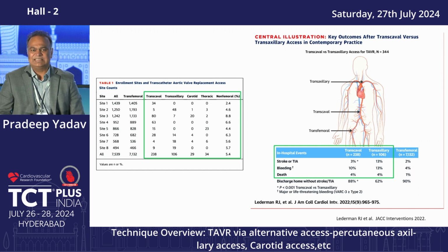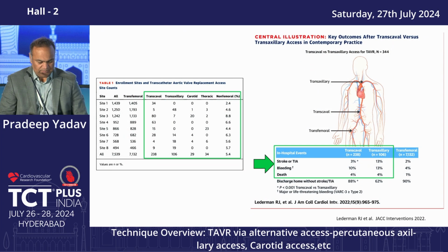Transcaval, so we haven't seen any excessive risk of stroke with transcaval. In this right table, you see that stroke risk with transcaval was no more than a regular TF case. Their main issue was bleeding, which was seen in axillary cases as well.